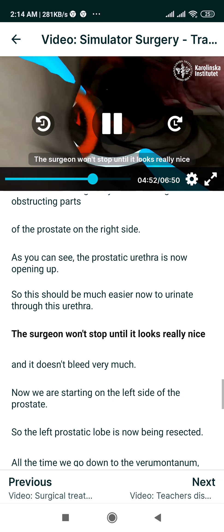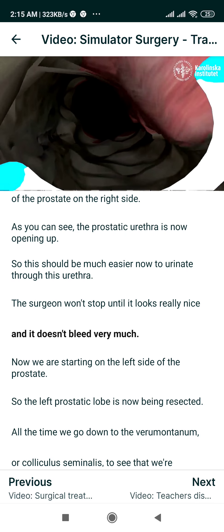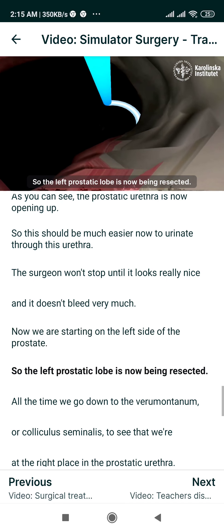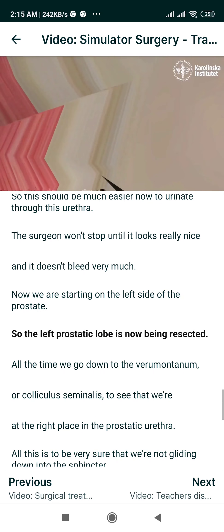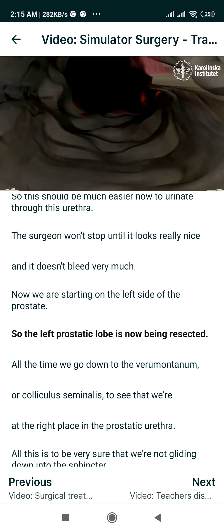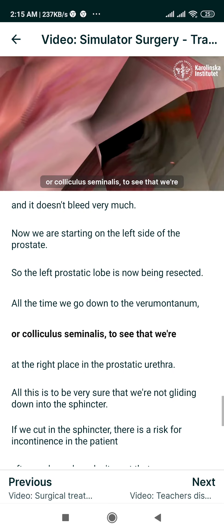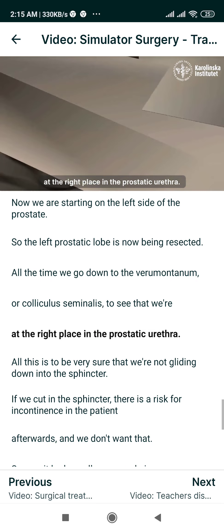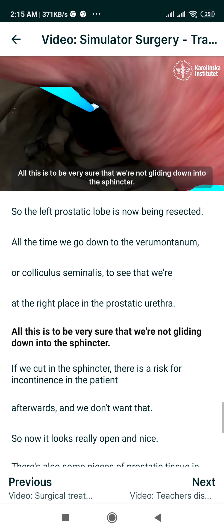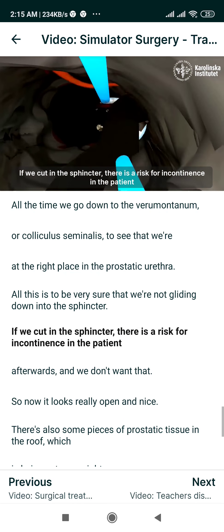The surgeon won't stop until it looks really nice and doesn't bleed very much. Now we are starting on the left side of the prostate, so the left prostatic lobe is now being resected. All the time we go down to the verumontanum, or colliculus seminalis, to see that we are at the right place in the prostatic urethra. This is to be very sure that we are not gliding down into the sphincter. If we cut in the sphincter there is a risk for incontinence in the patient afterwards, and we don't want that.